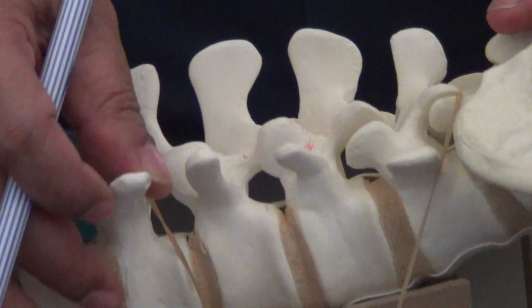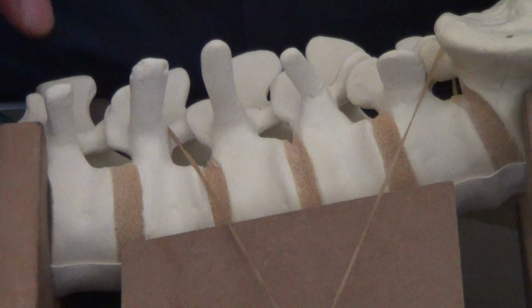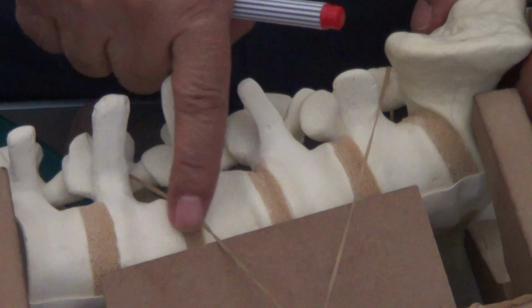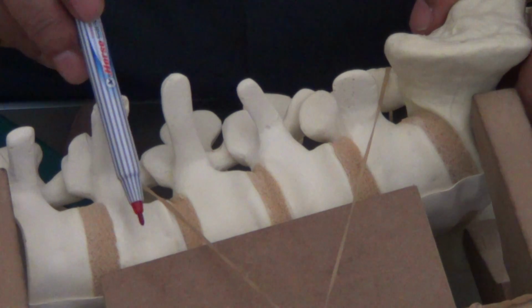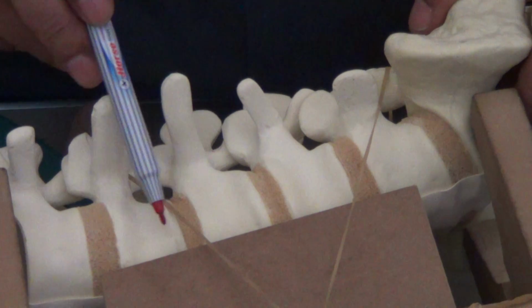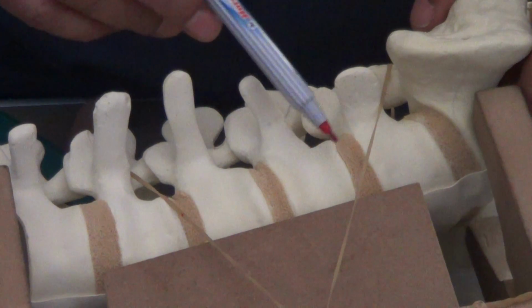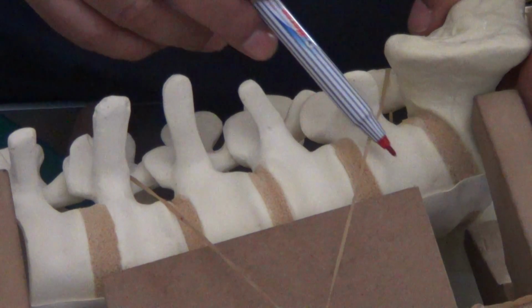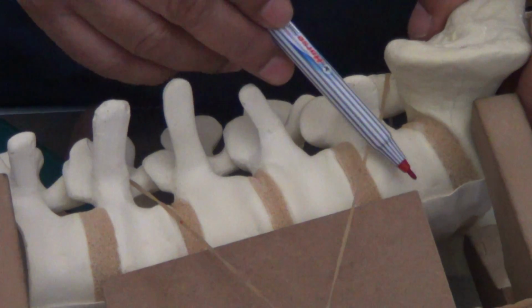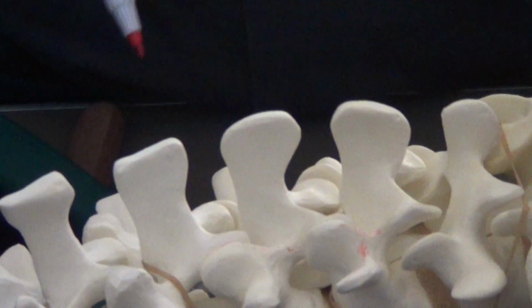Right? The other thing to notice is, as Juan was trying to say, the lumbar spine has got a curve here like this. So if you look at the direction of the pedicles, it is almost straight at L2 and L3, and then the pedicles start turning downwards, 15 degrees, 20 degrees, 30 degrees. So L5 will be about 25 degrees down caudal, and L3 would be vertical. So when you enter, you go there.